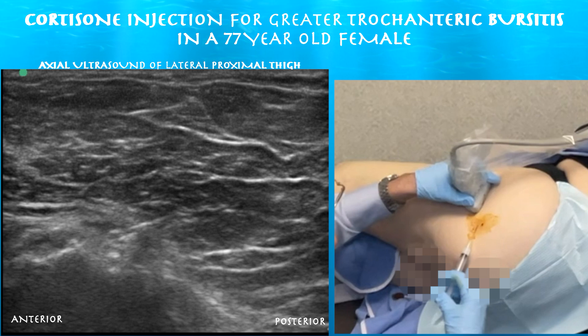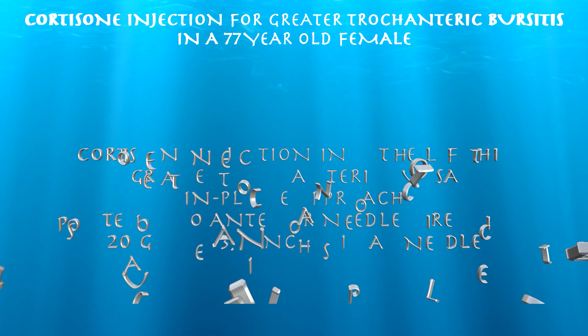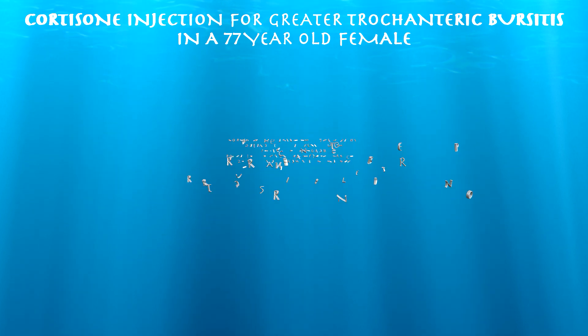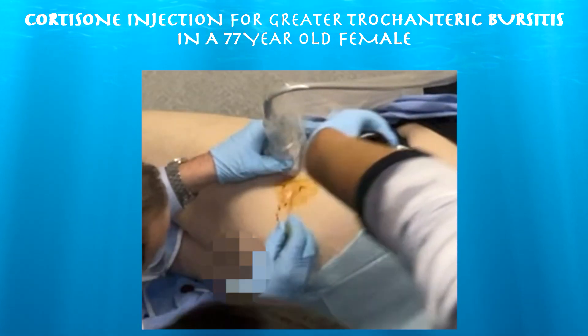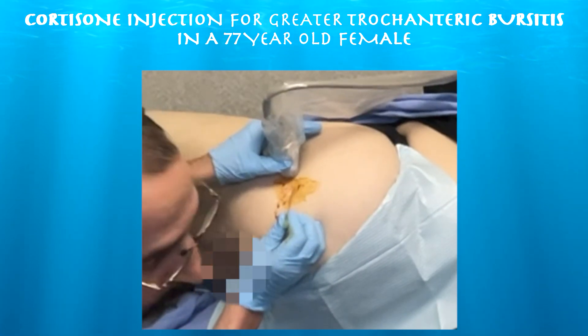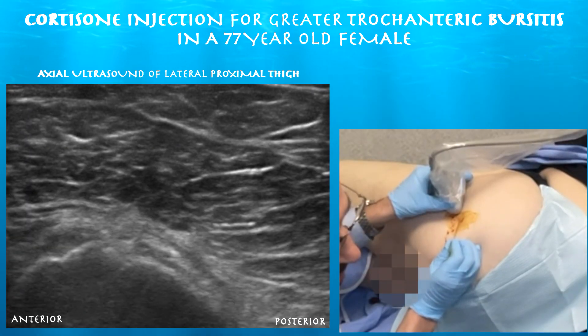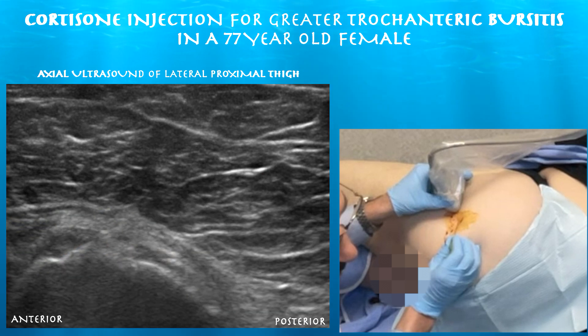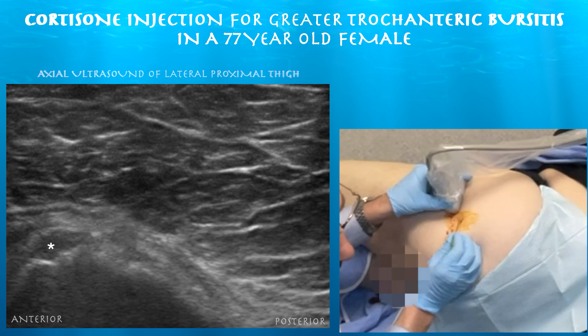Go ahead and do the injection. Here you can see the needle going in from a posterior to anterior direction. We're also tilted a little bit upwards, and here you can see the needle heading towards the apex of the greater trochanter. You can appreciate thickened gluteus medius and minimus tendons.